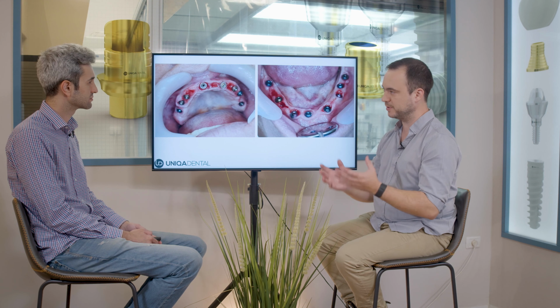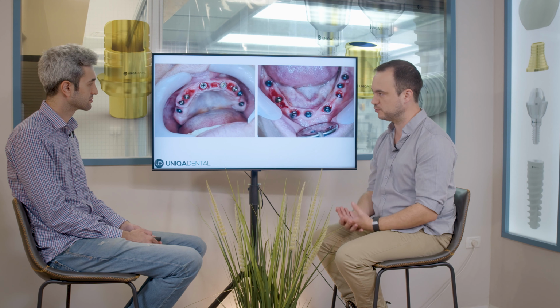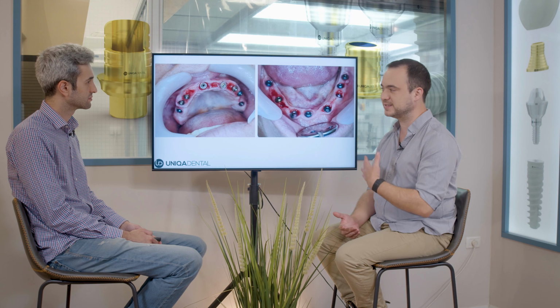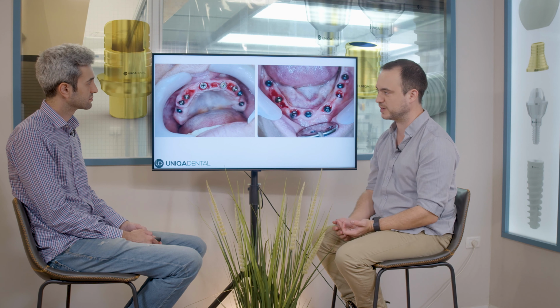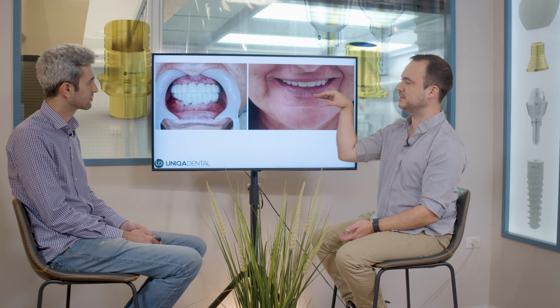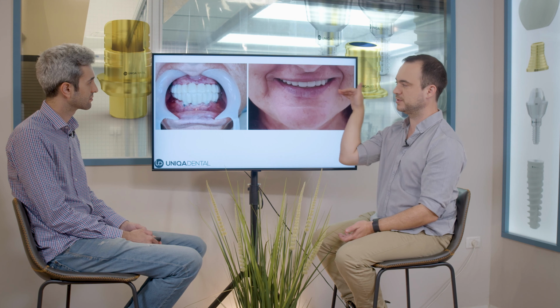Something you want to form in the process of the temporary bridges is also quite important. Now, you can see the third temporary bridge that we had. In this bridge, when she smiles, you can see the upper teeth. The incisors are almost the same size.